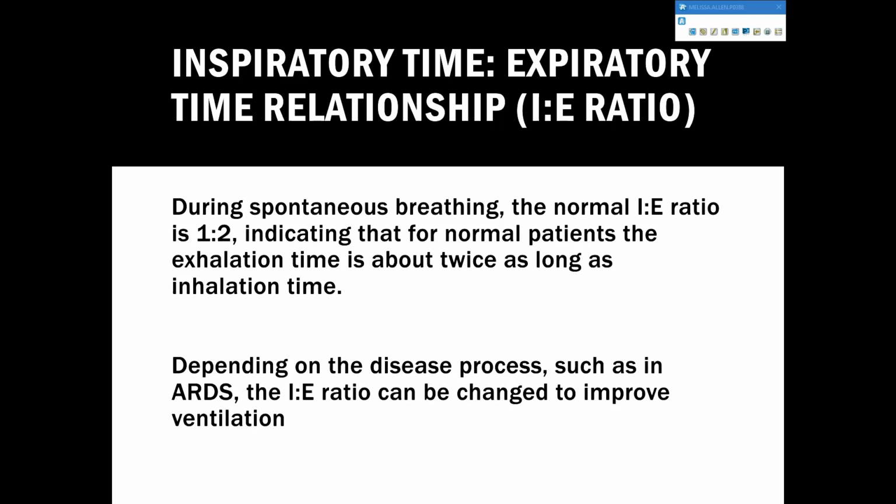But if we have a patient with ARDS, we want to think about those lungs. So let's imagine what's going on in our asthmatic and our emphysematic patient, right? This patient has all this air trapped in there. And so, yes, you can shove more air in with a machine, but it's hard to come out. So that's why you need to allow as much time as possible to get that air out, just like squeezing through those tiny, tiny inflamed airways, right?